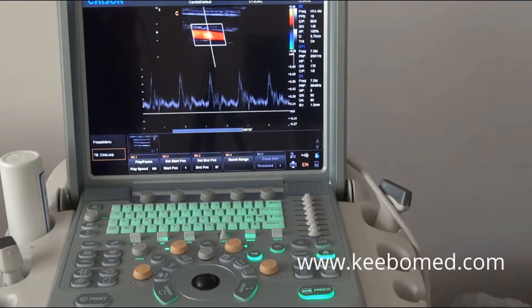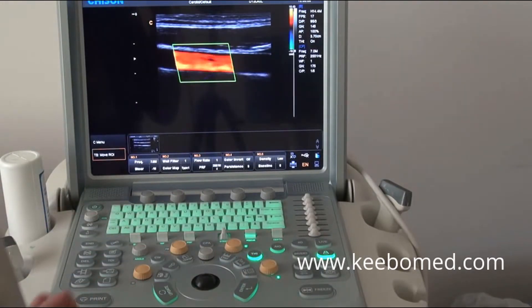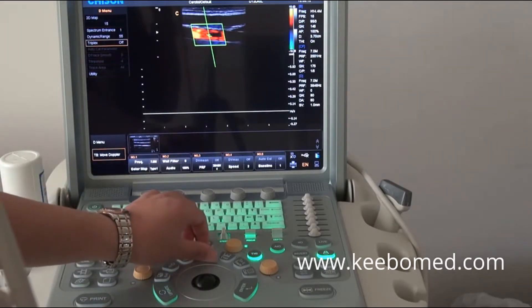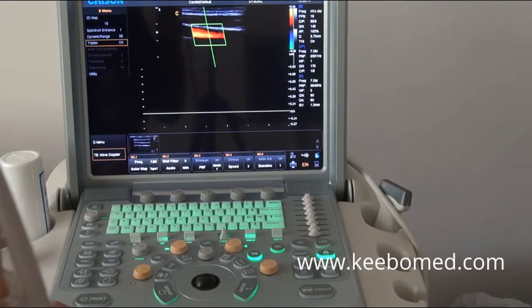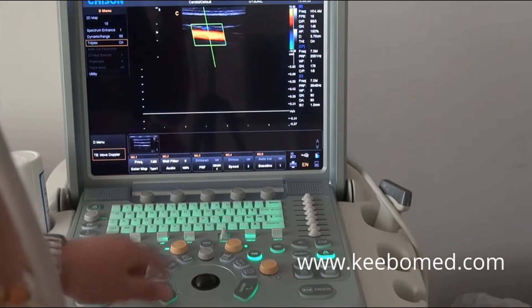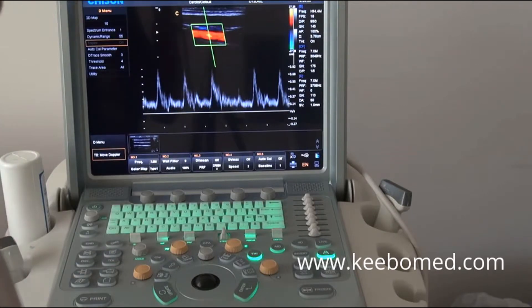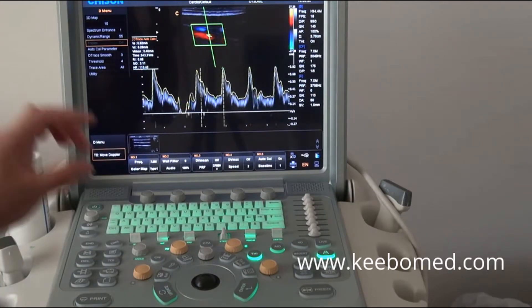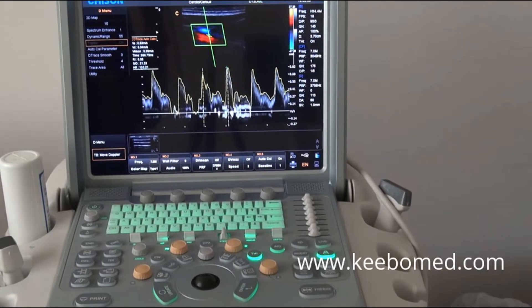After that, I will show you how to open some other functions, like triplex. Go into D mode and press the menu key. You will find triplex — press it to open it. Then press the update key. It has a high frame rate. We can press auto calculation and find the real-time results displayed on screen. It's very convenient for doctors' usage.